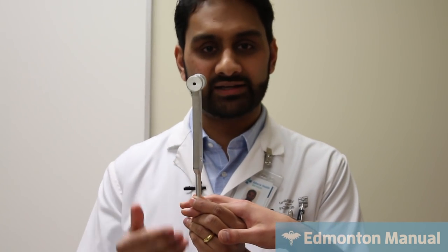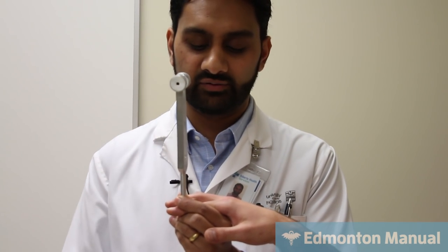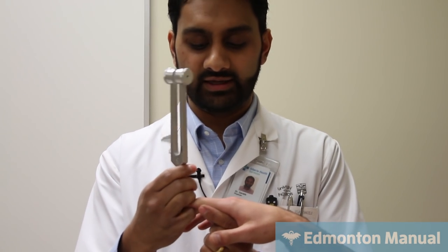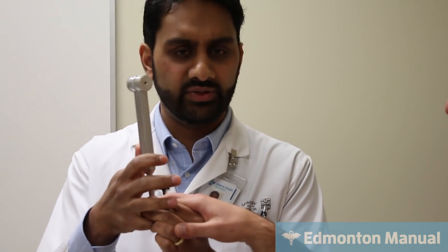It does take a bit of practice to hold it this way with one hand. Okay, but you should practice that because it allows you to have this hand free. A few other ways that you can do it is you can sort of hold it like this, with two hands, and then slowly put your hand up like that to hold it. That's also acceptable, just as long as you have something.